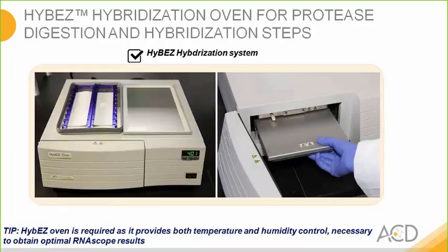Here we have the HybEZ hybridization oven in which you would complete the protease digestion and the hybridization steps. The HybEZ oven is required as it provides both the temperature and humidity control that's necessary to obtain optimal RNAscope results.